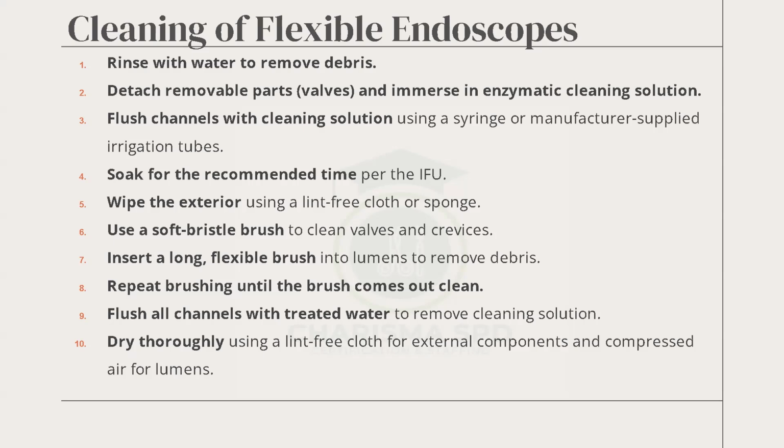Insert long, flexible brushes to clear the debris in the lumens. Repeat brushing until the brush comes out clean, and then flush channels so that you don't leave lint from the brush. Okay, that's why we flush them, and then dry thoroughly. Next slide.